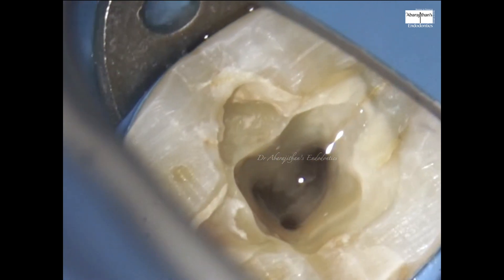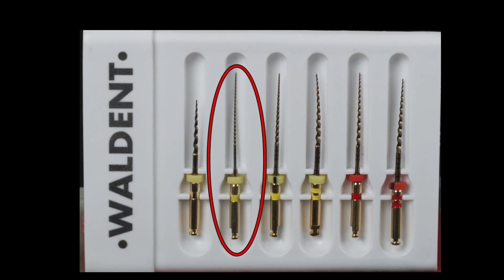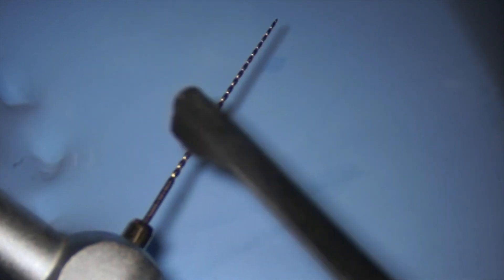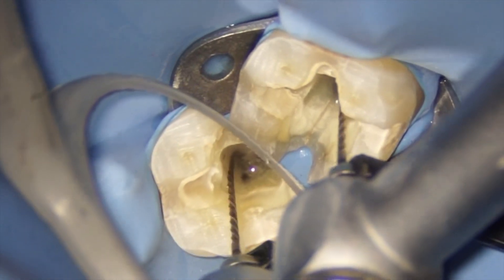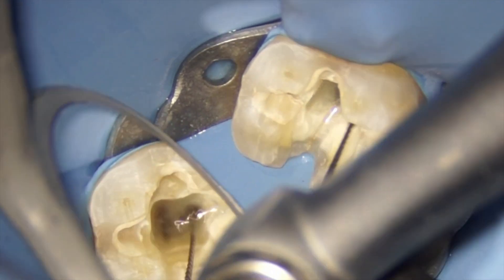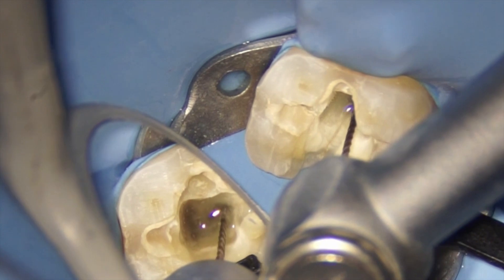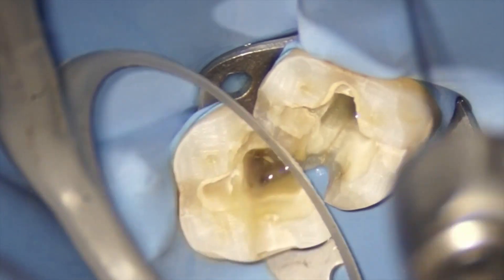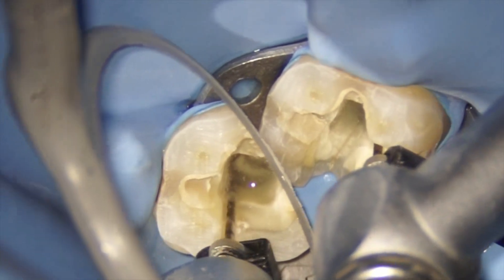We will never use the file dry in the canal, so we place a lot of irrigant as a reservoir, which acts as a lubricant and also reduces frictional fatigue. The next file is the rotary glide path file, which is a 19/0.02 file. Since we do not use manual K files for working length determination, I've attached the apex locator file holder to the rotary files so we can determine working length and also have adequate length control during rotary instrumentation. This is an independent apex locator connected to the endomotor during rotation.